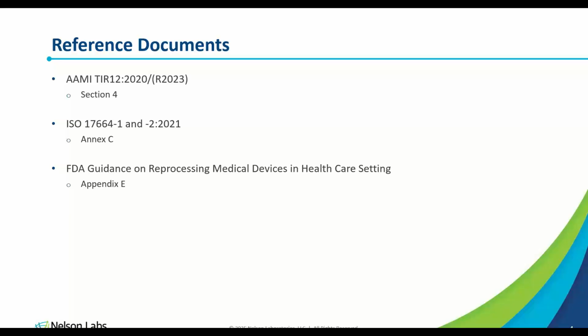You can do total organic carbon. Really, you just need to select at least two, and the first one needs to be protein, and then the second one, I would generally choose hemoglobin or total organic carbon. You can do carbohydrates if for whatever reason hemoglobin and total organic carbon are unavailable. Carbohydrates can be chosen, although it's less popular.